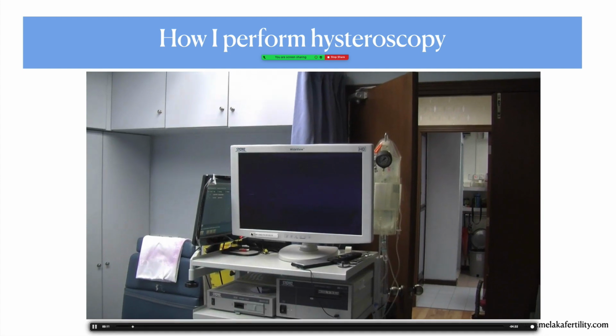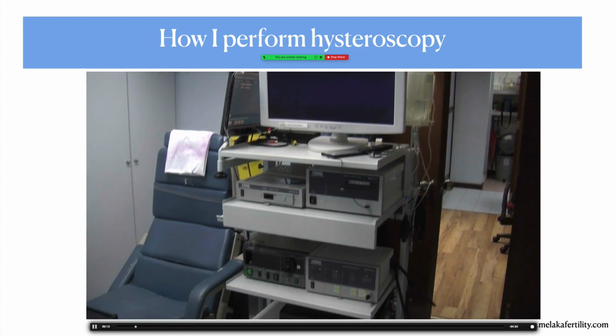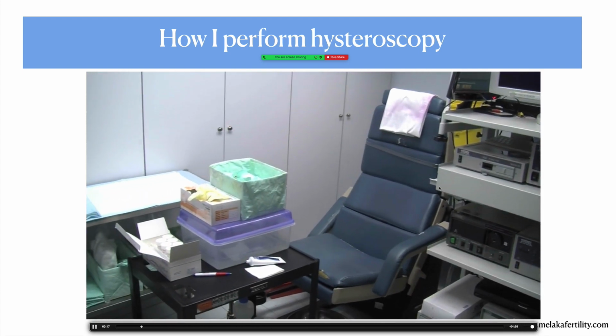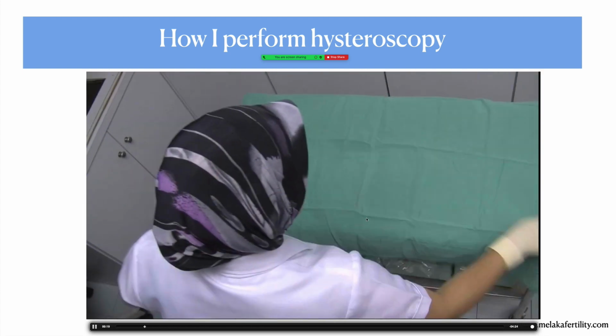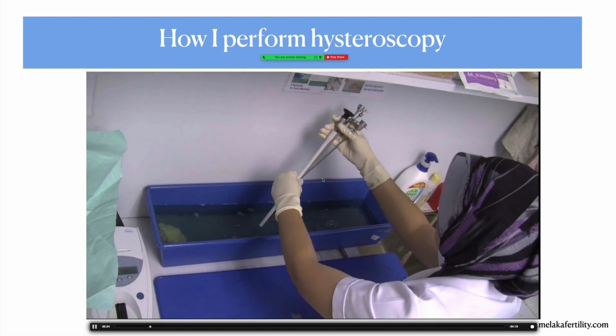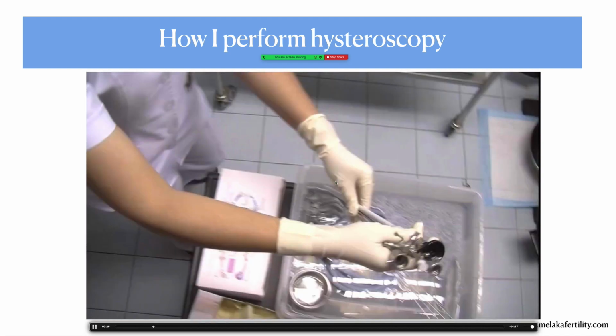This is the tower that I have. It has got the basic setup, so you can actually do laparoscopy with this, but for performing the office hysteroscopy, this is a chair, and this is how my nurse is preparing the instruments, and she will be preparing all this, setting it up, and I'll be consulting patients.